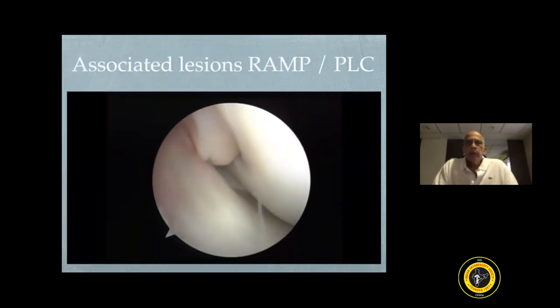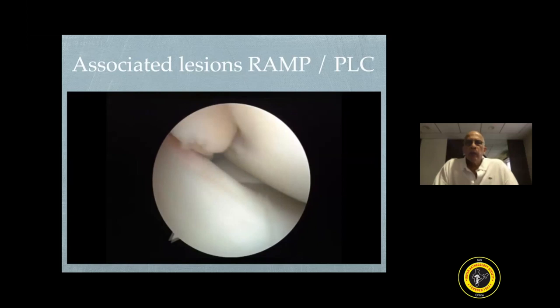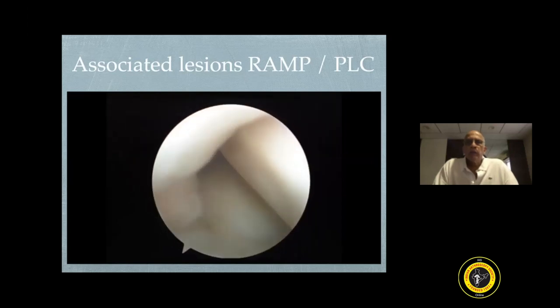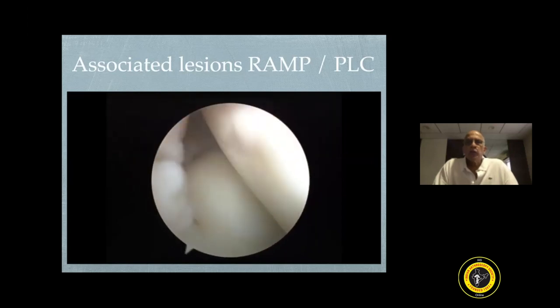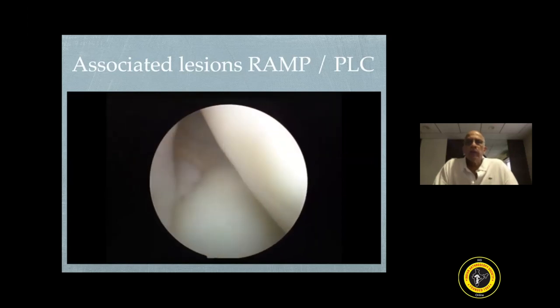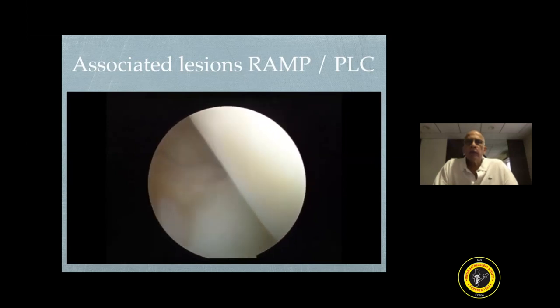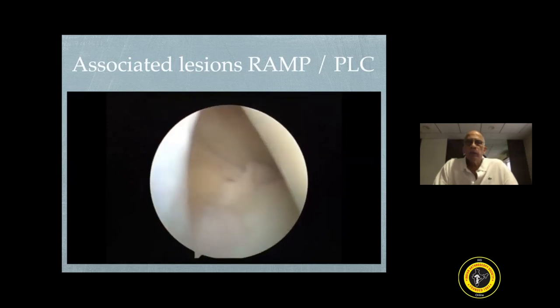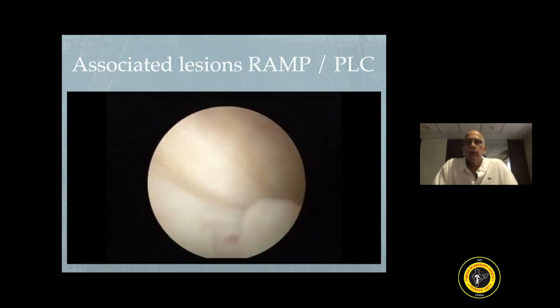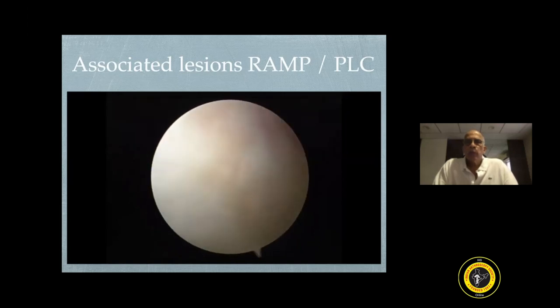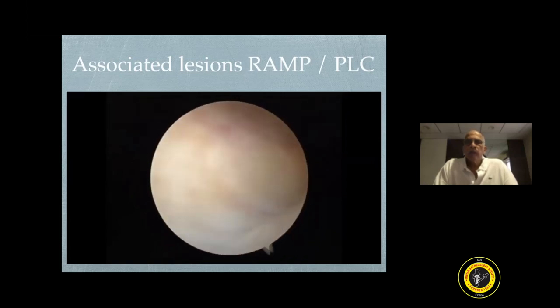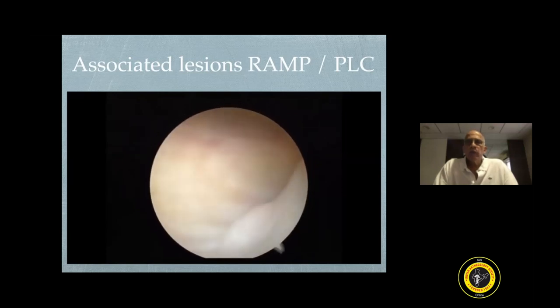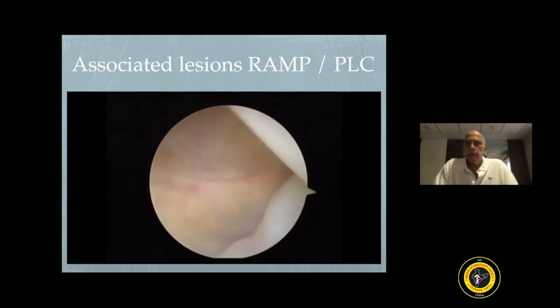Here is a video which shows how to approach the ramp lesion. One gently passes the scope between the medial femoral condyle and the posterior cruciate ligament and approaches the posteromedial corner. Ramp lesions are basically menisco-capsular separations which are seen in this area.